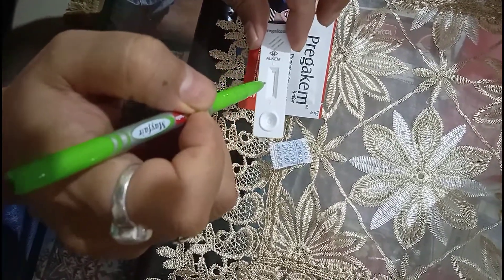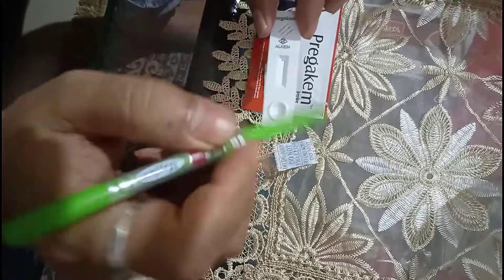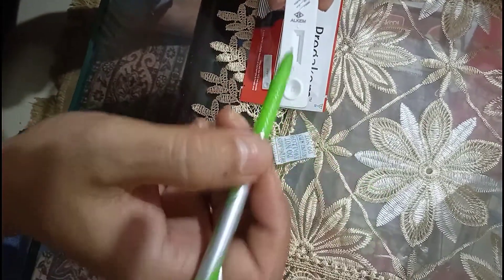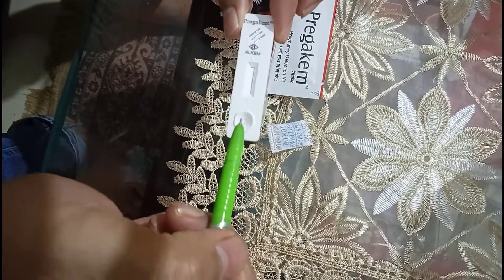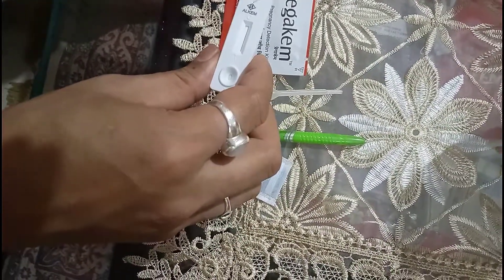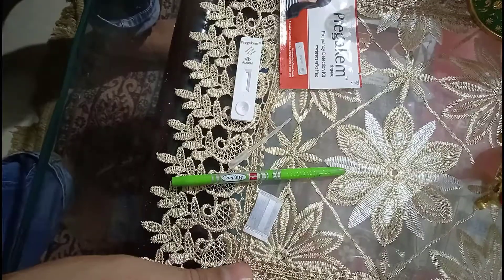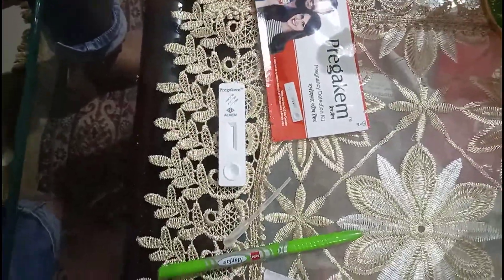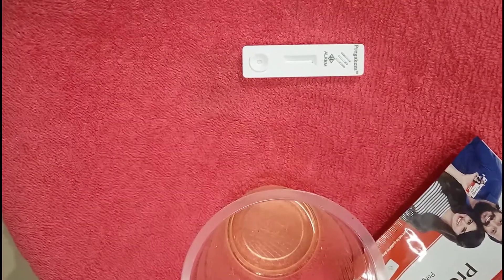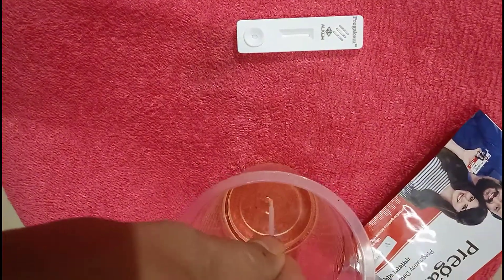The mechanism is that the placenta of a pregnant woman secretes a hormone called human chorionic gonadotropin, which comes out with the urine. When it comes into contact with the chemical — an antibody-like substance in the test device — the indicator color changes into pink color.